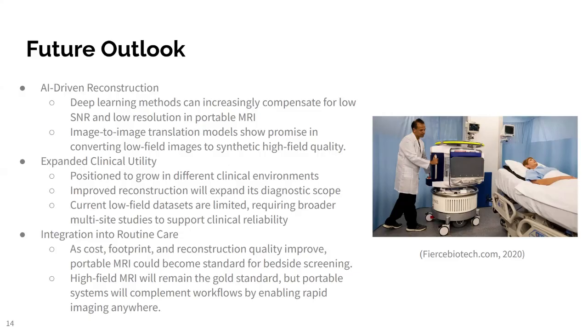Integration into routine care. With better cost, size, and reconstruction quality, portable MRI could become a bedside screening tool that complements rather than replaces high-field MRI.